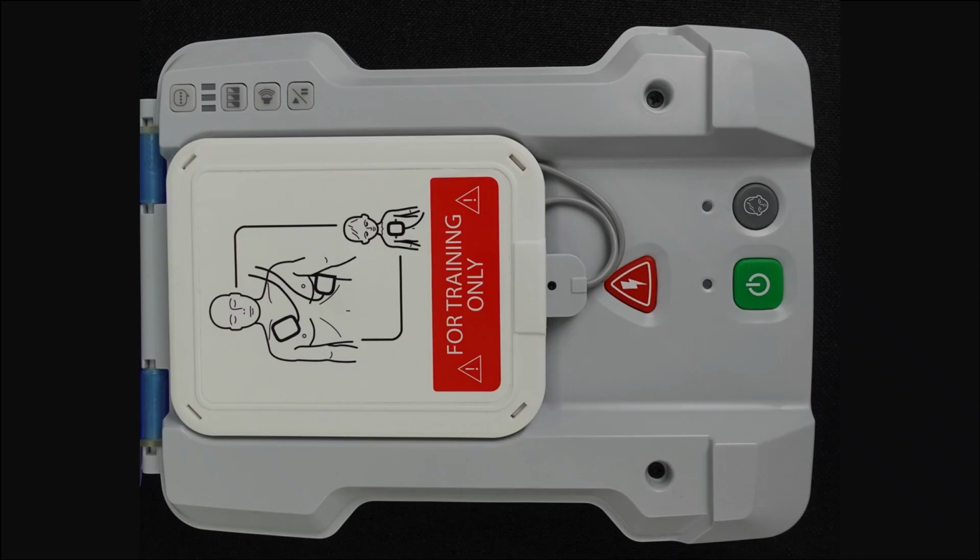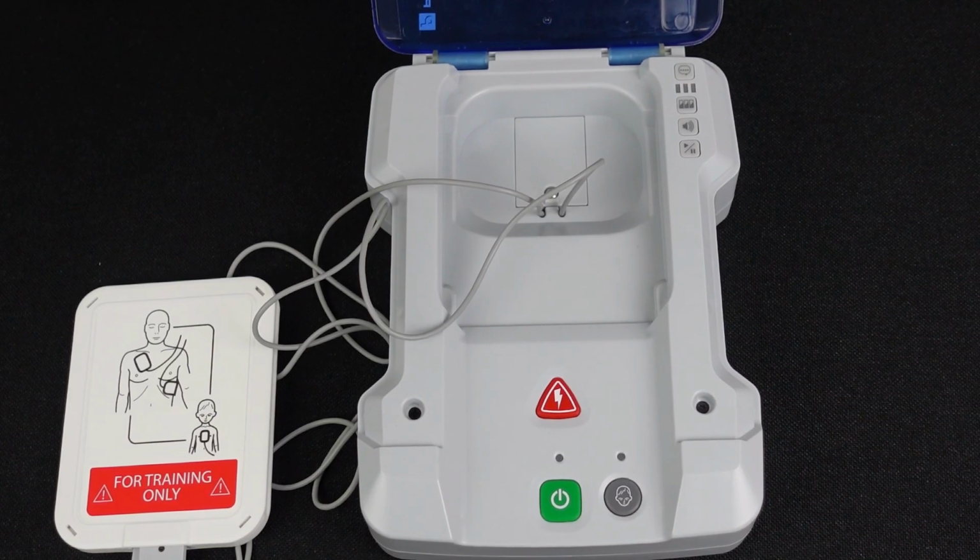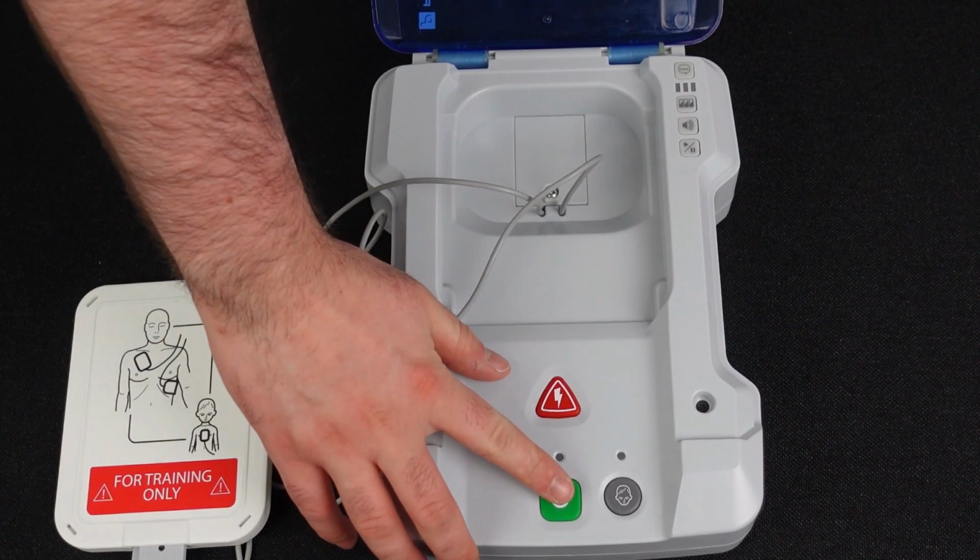Let's quickly go over the buttons on the AED before we get started. From left to right, we have the language button, the scenario selection button, the volume button, the play pause button, the red shock button, the green power button, and the gray child button. Hold down the green power button until you hear two beeps.